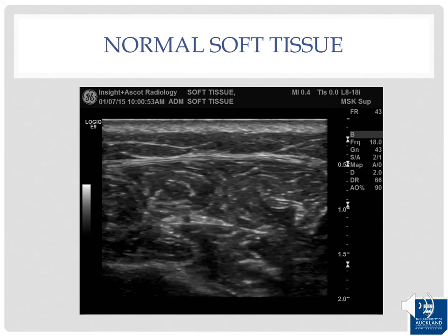Reviewing normal soft tissue appearances: the dermis appears as a thin hyperechoic layer. Deep to this is the subcutaneous layer, which is hypoechoic with hypoechoic fat interspersed with hyperechoic linear echoes running mostly parallel to the skin representing the connective tissue septae. Deep to that is the linear hyperechoic fascia, and below that is muscle — hypoechoic cylindrical structures with hyperechoic connective tissue (perimysium) surrounding them.